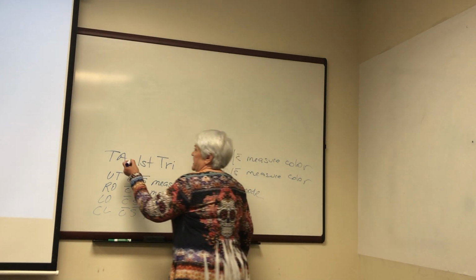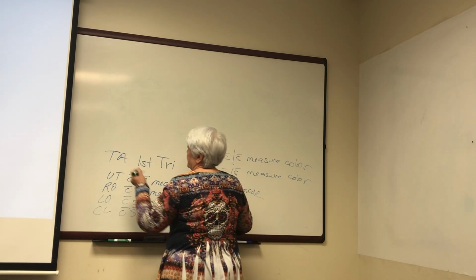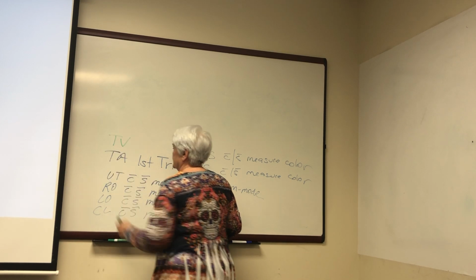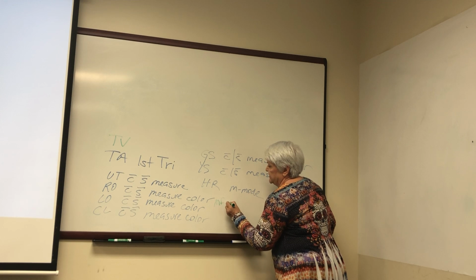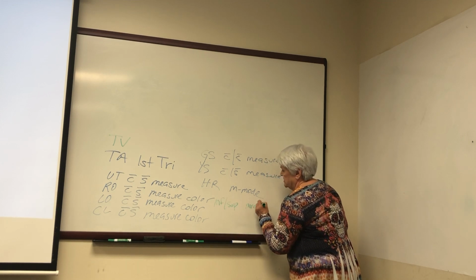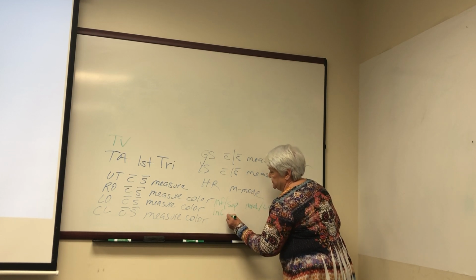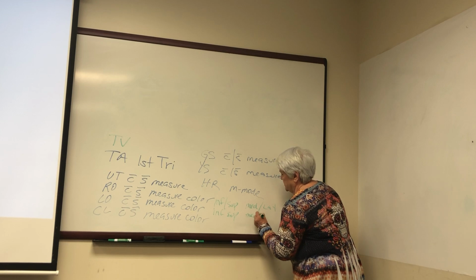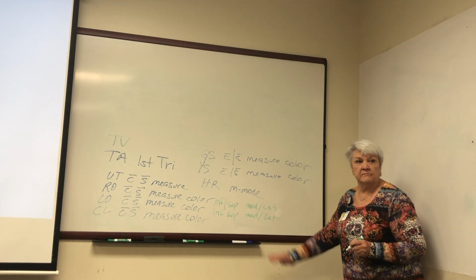It's the exact same for transvaginal, except for now, I'm going to do inferior, superior, medial, lateral. Inferior, superior, medial, lateral. Okay, and that's it.